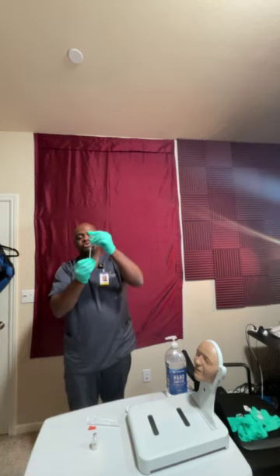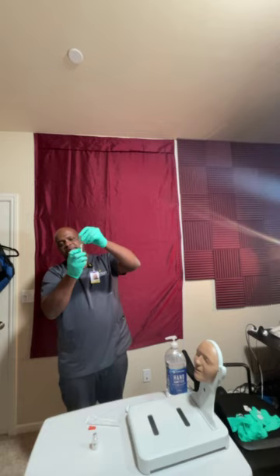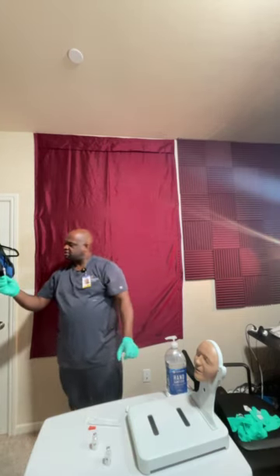Now this time I'm going to invert the bottle and withdraw 4 units of insulin from here. Slowly withdraw. Make sure that I'm on 4 units. Okay. Tap the syringe to make sure there's no bubbles. Right, if there's any bubbles, I'll tap the syringe. Right, everything looks good. I'll confirm with the fellow nurse that there is 4 units of insulin in there. Okay, now I'll confirm with you guys there's 4 units of insulin in that syringe as well.